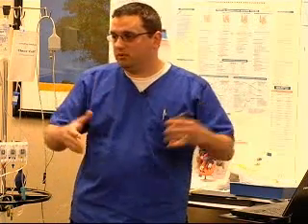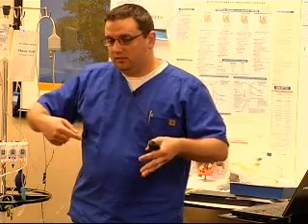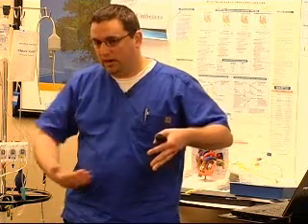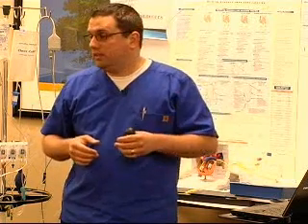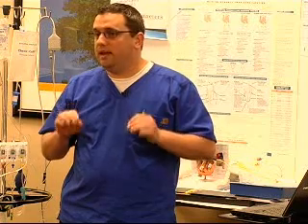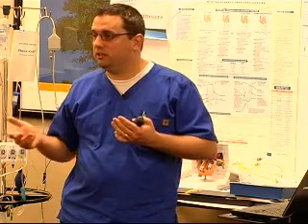When you're thinking about volume, think about the ventricles and the amount of space that you have. If that volume space is big initially, you're going to have more area. Then as you've diuresed your patient, the ventricle gets smaller, so the catheter is going to be farther in. You can pull the catheter back. 3 to 4 centimeters is usually about the most you'd want to move it without any kind of physician intervention otherwise.